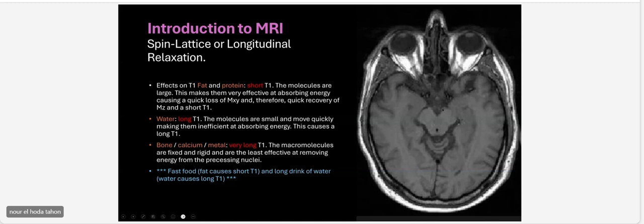And again, here, this is like the CSF spaces. It's between the sulci here. It's dark, like any fluid, like CSF. And here the basal cisterns are also dark.